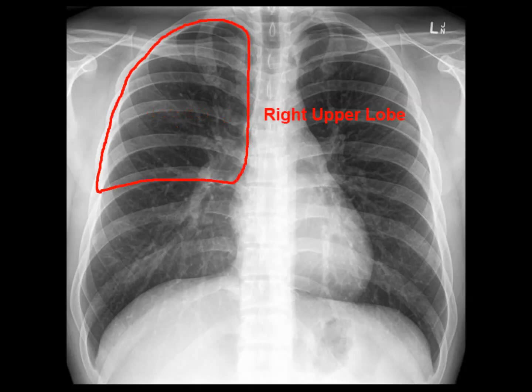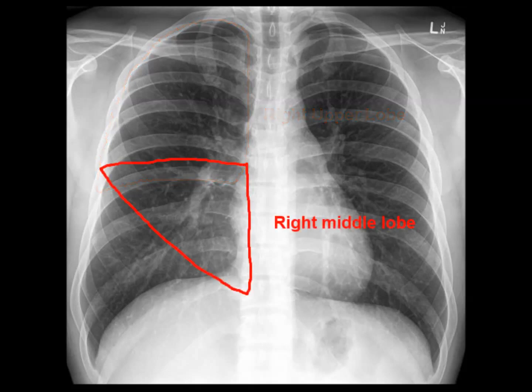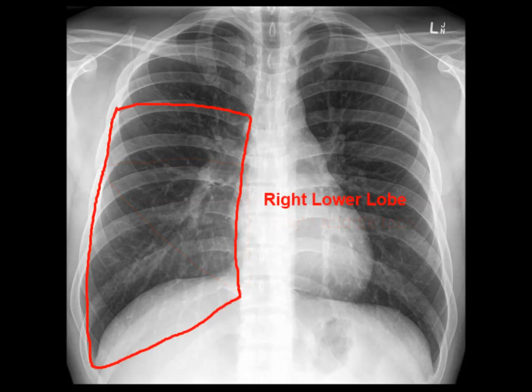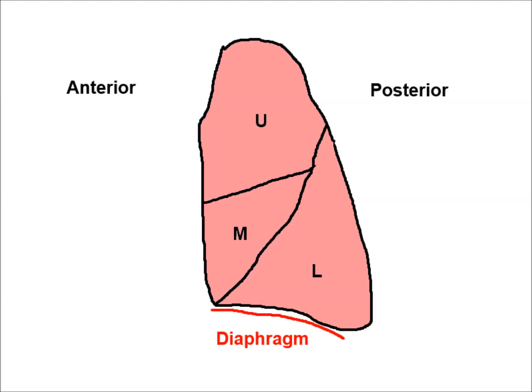Now onto the lung fields, starting with the lobes. On the right: the right upper lobe, then the right middle lobe — which touches the right heart border — and the right lower lobe, which touches the right hemidiaphragm. There is some overlap between lobes, particularly between the lower lobe and the other two, because of the three-dimensional structure of the lungs. The lower lobe occupies a space posterior to the other two lobes and also to the dome of the diaphragm — it doesn't touch the right heart border because the heart is anterior in the chest.